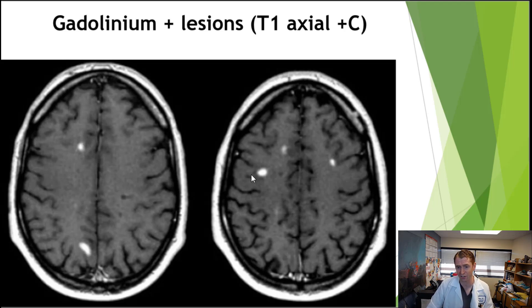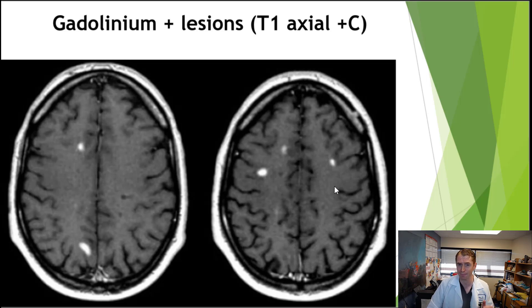You can see this very bright avid enhancement, which is typical for new multiple sclerosis lesions. They often enhance for approximately one month after formation. This would be atypical for a small subcortical stroke, even if it's acute.